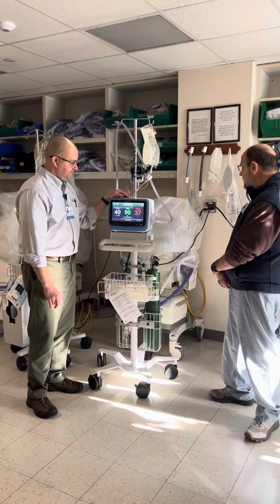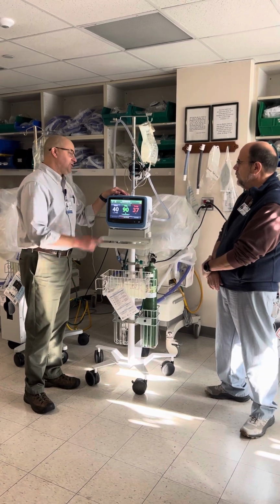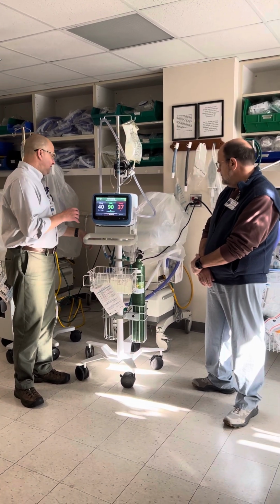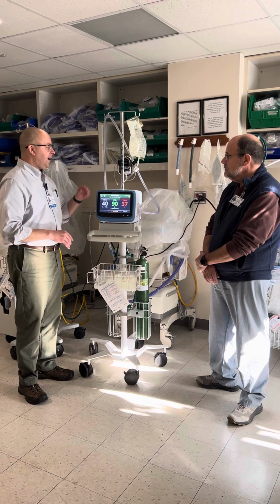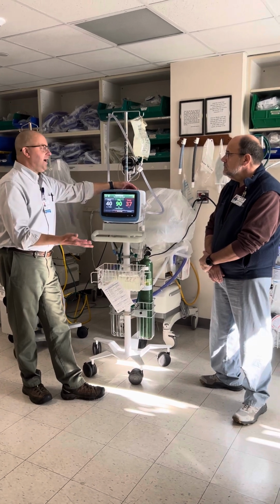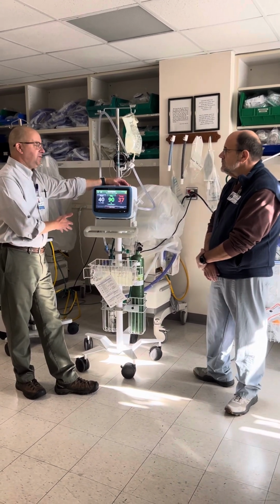What do you think is the lifespan of a single tank for somebody who's at 40 liters with 100%? That's a great question. The recommendation is we always put 2 tanks on. The device is designed to pull from one tank and then the other. You can imagine at 40 liters a minute on an E-cylinder, you may get an hour out of the tank. Don't want to risk it, so we always put 2 tanks on to be on the safe side.